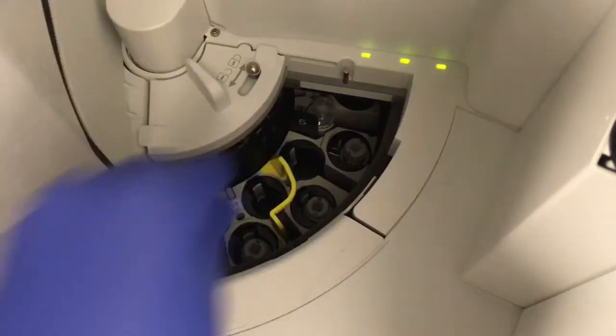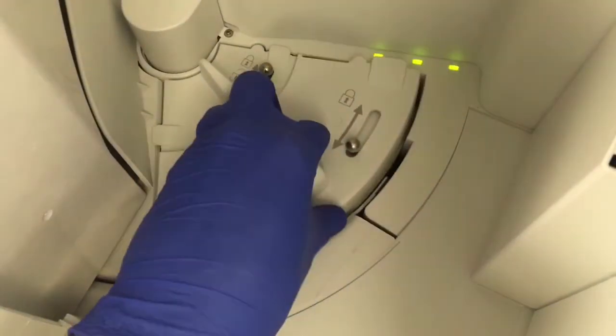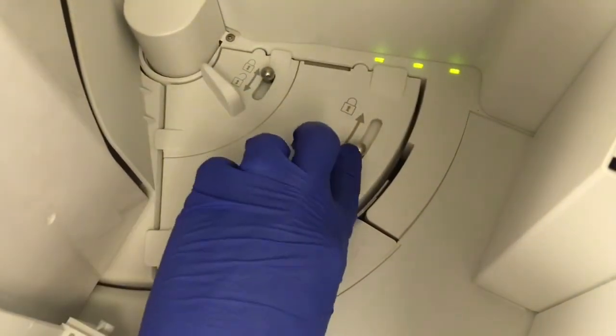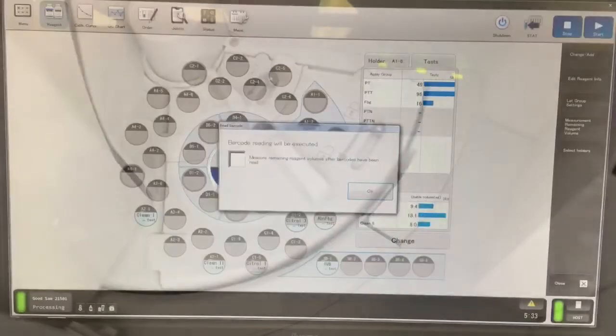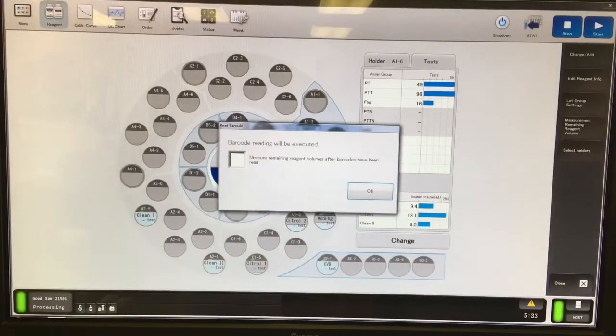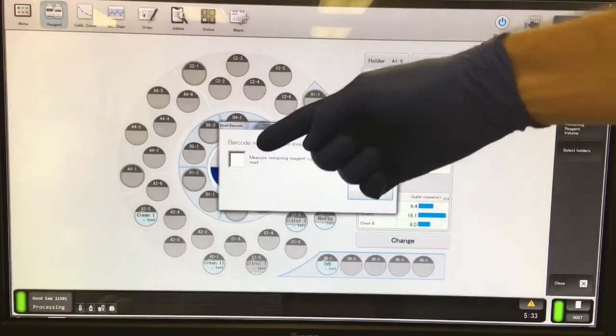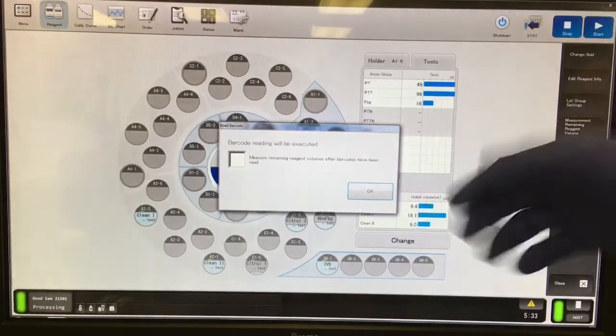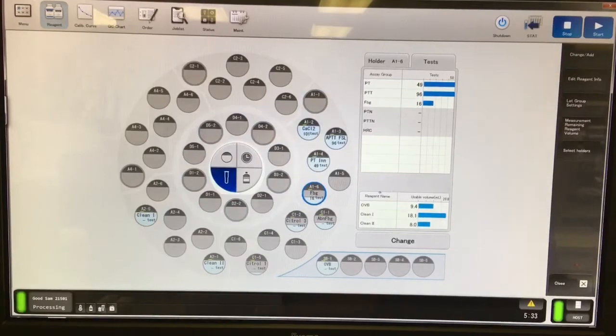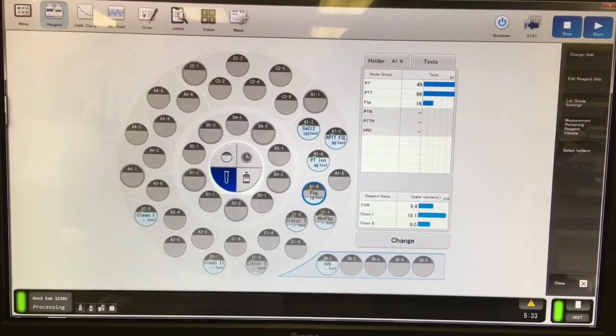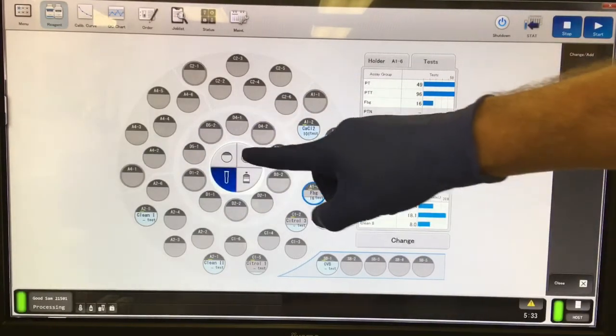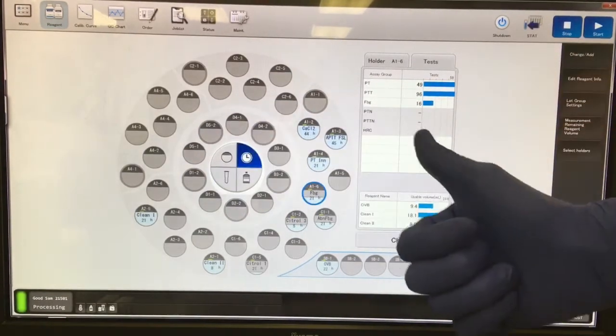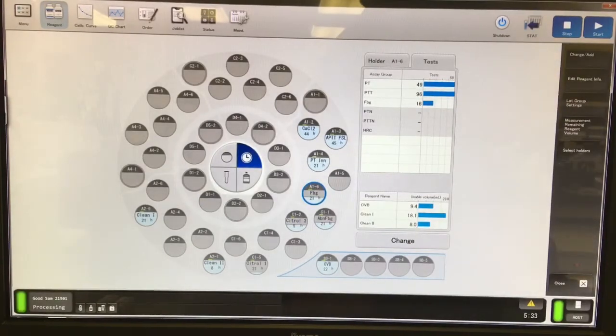Once you've changed the reagent, go ahead and place it back inside, and replace the cover and lock it. Once you do that, it's going to ask you if you want to update all the volumes currently. You can just skip that because it takes a few minutes and it'll just do it automatically whenever you go to use the reagent.